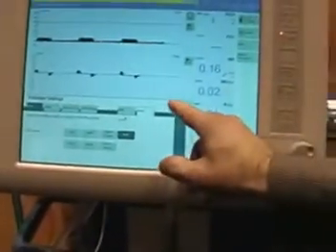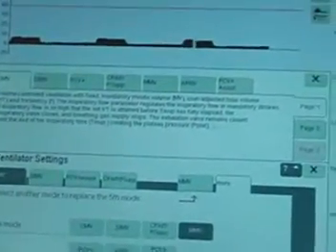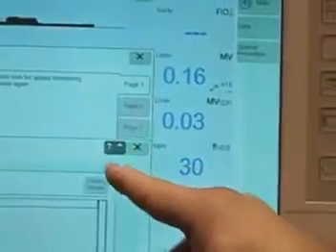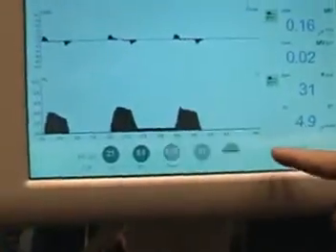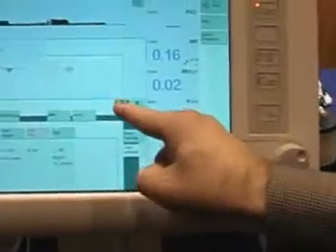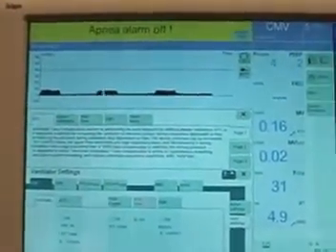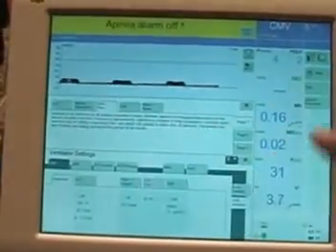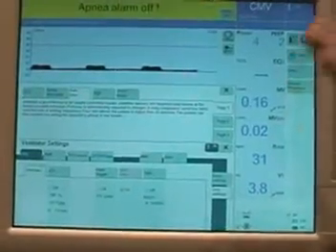We've built the entire operator's manual into the ventilator. If you select a mode, you get a definition and explanation — for example, APRV has two pages describing what it does and how it operates. Any time an alarm occurs, it always gives you the cause and remedy, accessible via the question mark button. Additional settings include automatic tube compensation, which works in adult, peds, and neo, as well as apnea ventilation and auto flow — all integrated here.